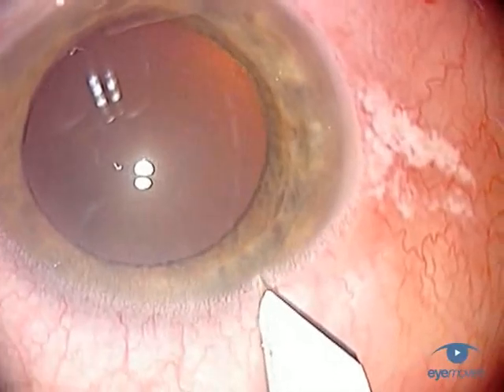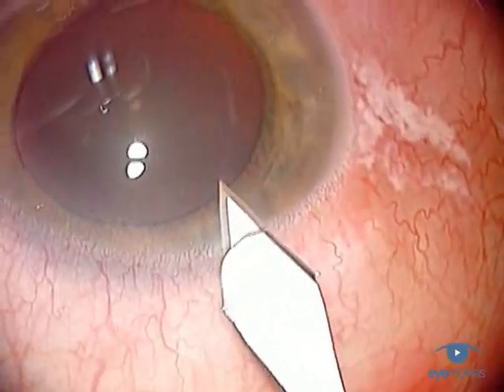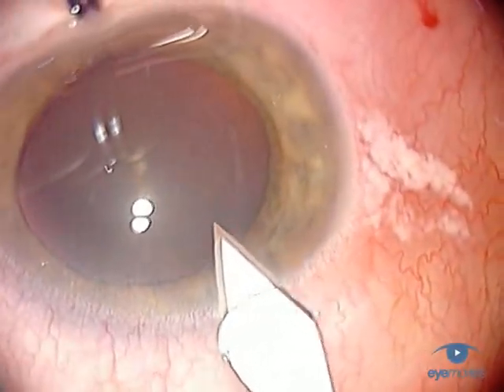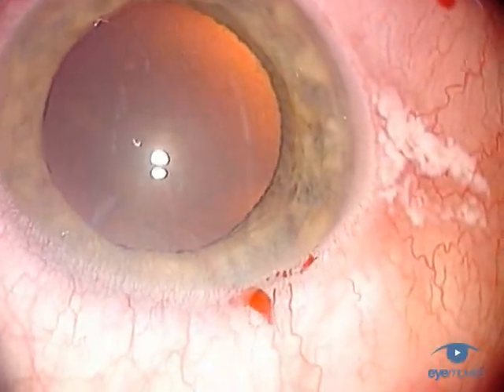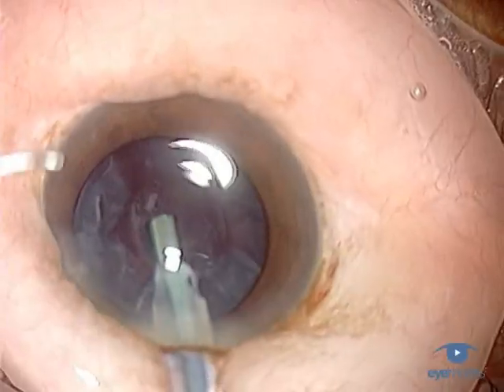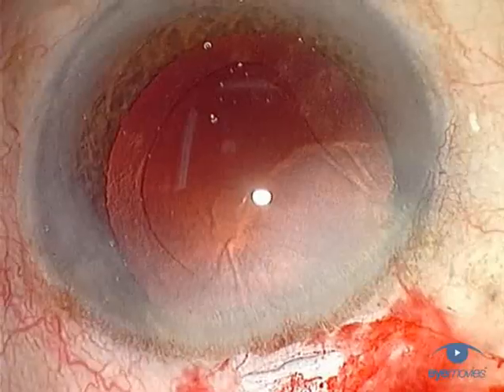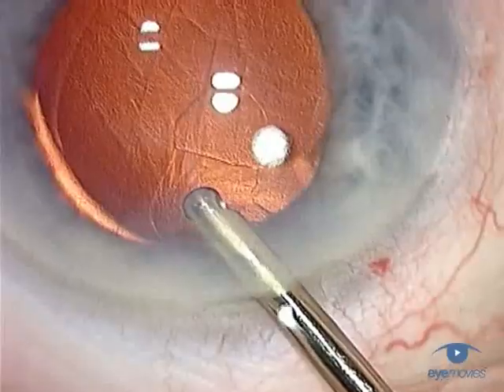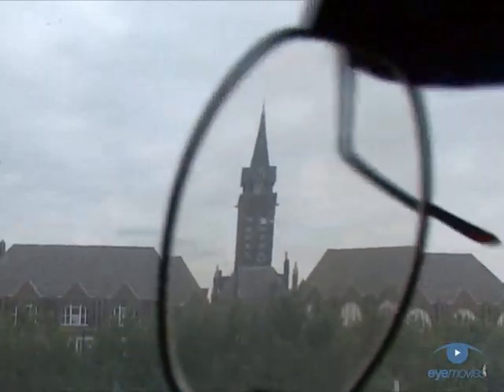Each step of phaco surgery is critically important, and probably none more so than the incision. Any error with the incision can have significant consequences both during surgery and further down the line. Some well-known intraoperative problems include conjunctival ballooning if it's too posterior, wound burn if it's too tight, and peeling of Descemet's membrane. Postoperative problems can range from induced astigmatism if the incision is too central or too wide, to an increased risk of endophthalmitis if it's not watertight.